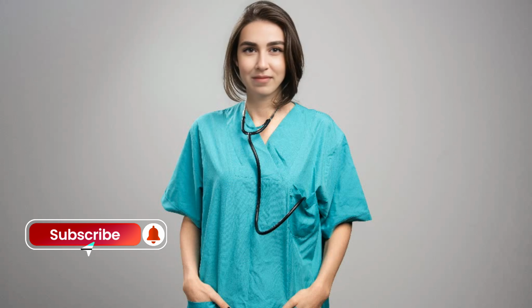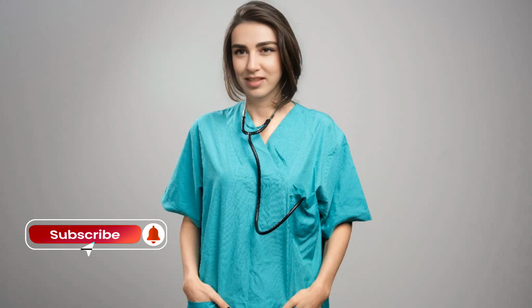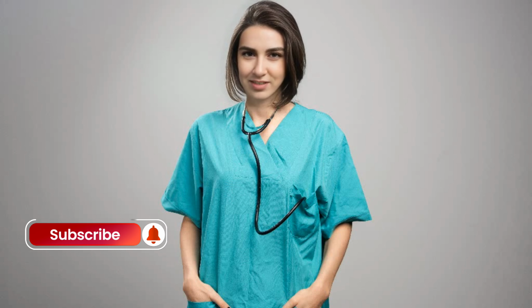5. Quick recovery: most patients can return to regular activities within a few days to a week. 6. Performed in cath lab: this procedure is typically done in a catheterization laboratory, cath lab, instead of an operating room. 7. Sedation and local anesthesia: patients are awake but sedated, with a local anesthetic at the insertion site.